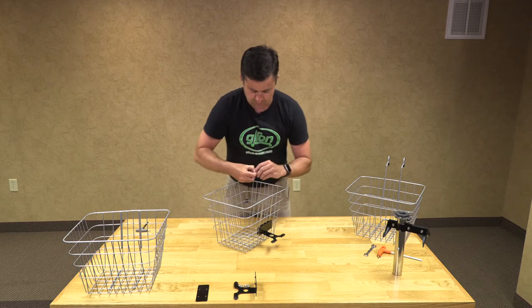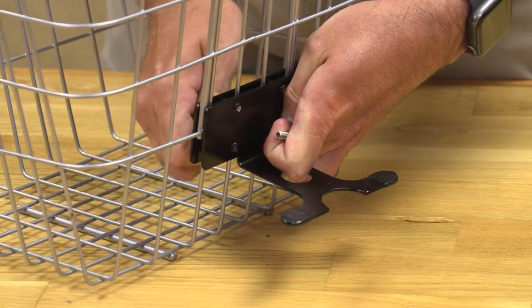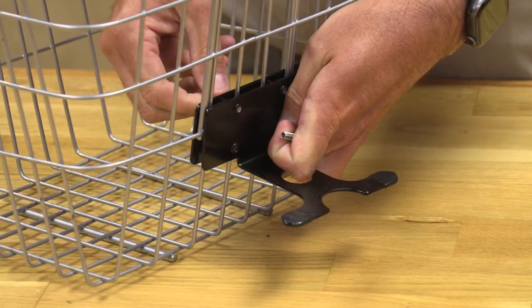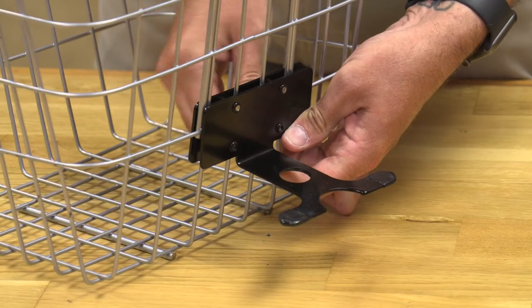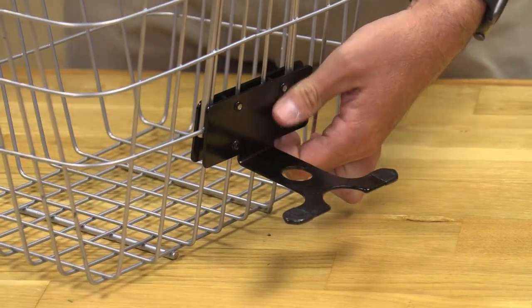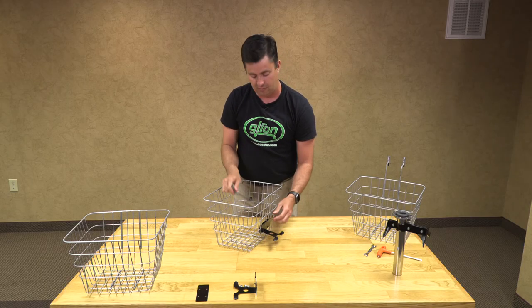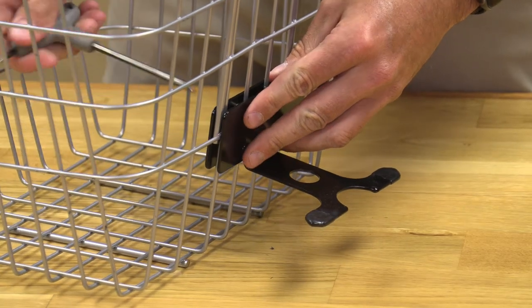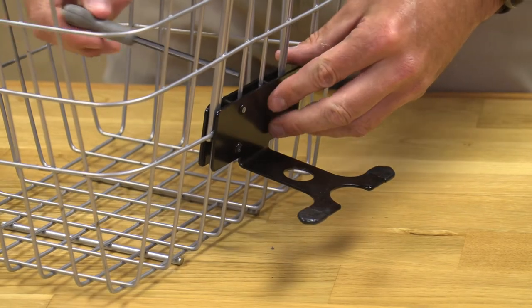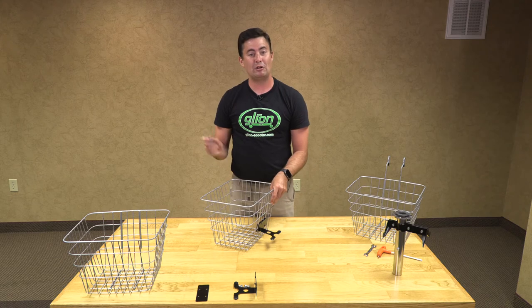Then we will take our other two bolts and put those in place. You may have to squeeze it lightly or loosen your top bolt if it does not quite fit. Then you will take an Allen wrench and tighten it down — don't over-tighten it because you can bend the metal. You will do the exact same installation on your other basket.